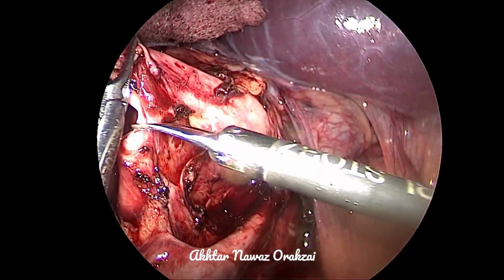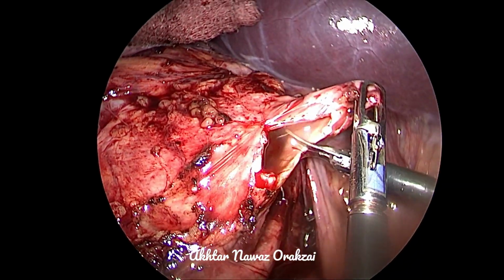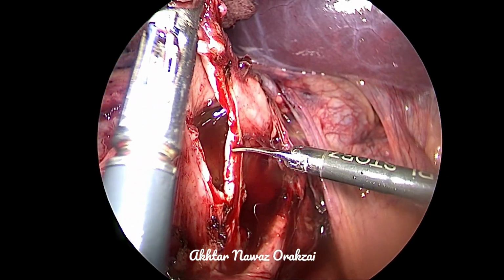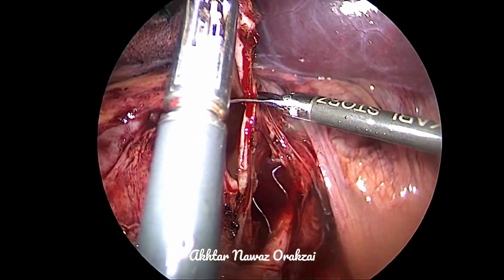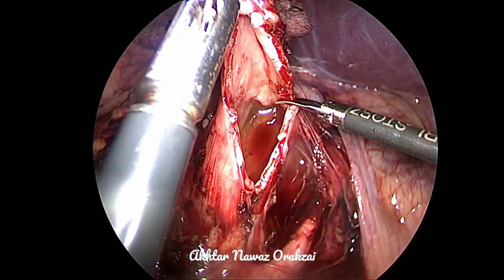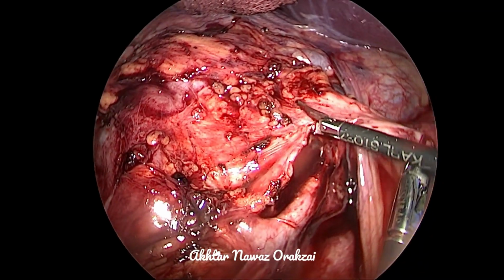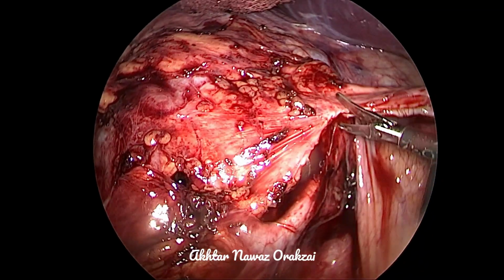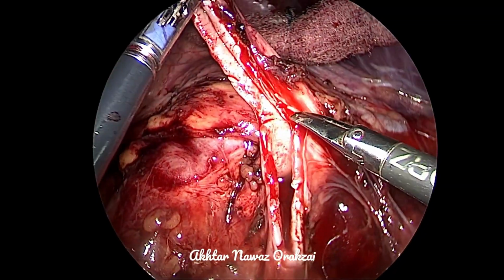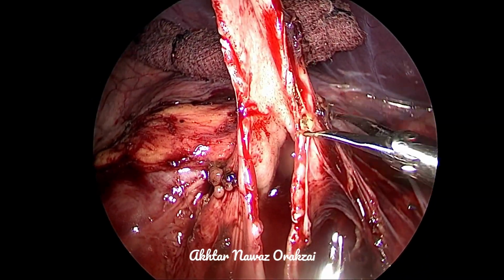Remember from the previous lectures, do not over-excise the pelvis, because if you are stretching the pelvis and you are cutting it, you would attempt to cut more and more of the pelvis, and by the end you find that you have also arrived upon the calyces. So try to excise minimum. Later on, if you want, you can cut more, but once you cut excessively, you cannot reattach the cut portion.